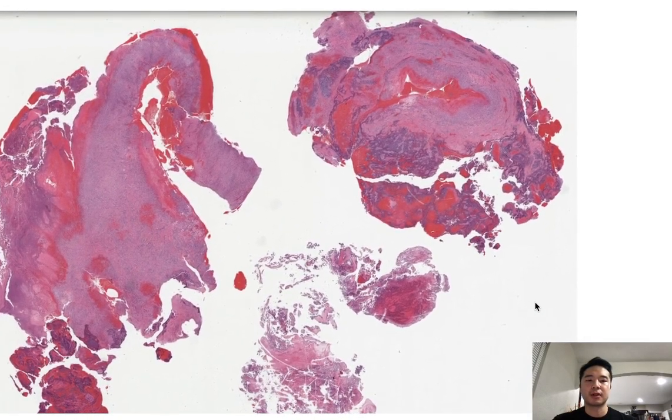Hello, today we're going to talk about Ewing sarcoma. Thank you to Path Presenter for this slide of a child with a painful bone mass. It should show a periosteal kind of reaction to it.